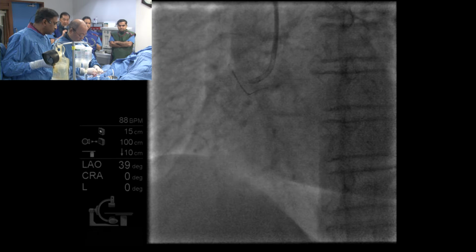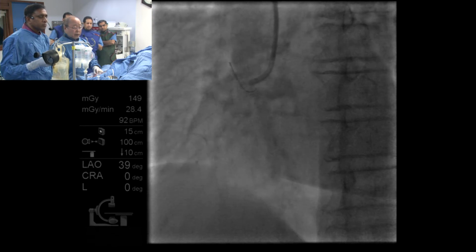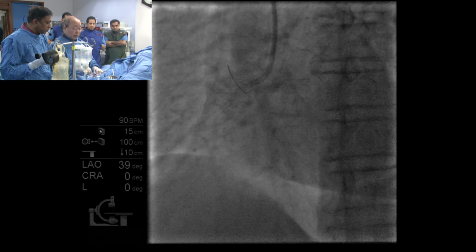So Dr. Saito, why are you not using two catheters? You have one catheter here or two catheters here? One catheter, because we removed the left coronary catheter, because that provides no information. No information. That means no collateral. And also, there is some septal connection, but that route is too tortuous.